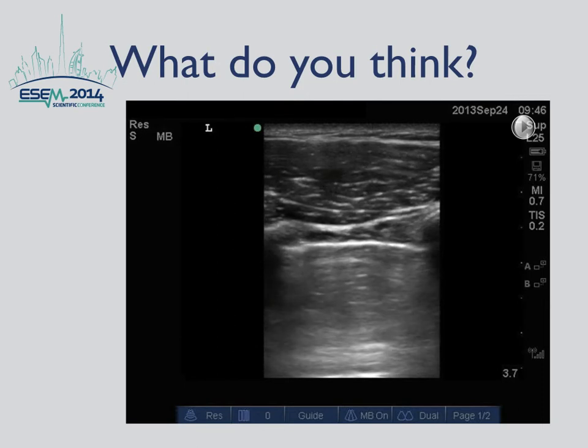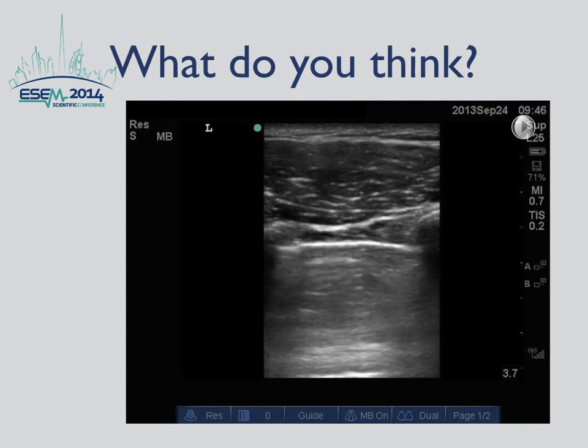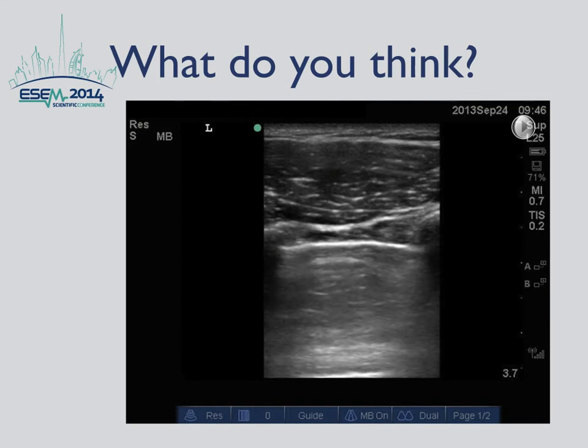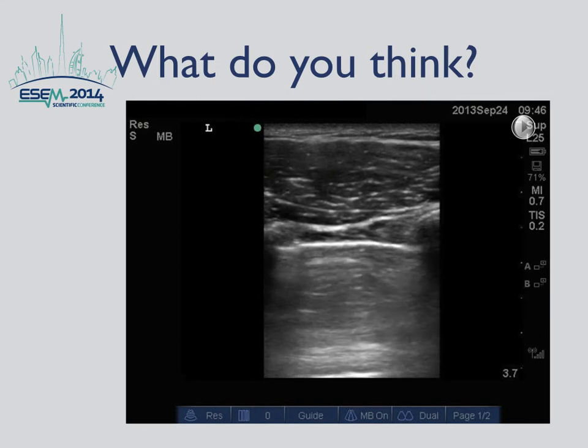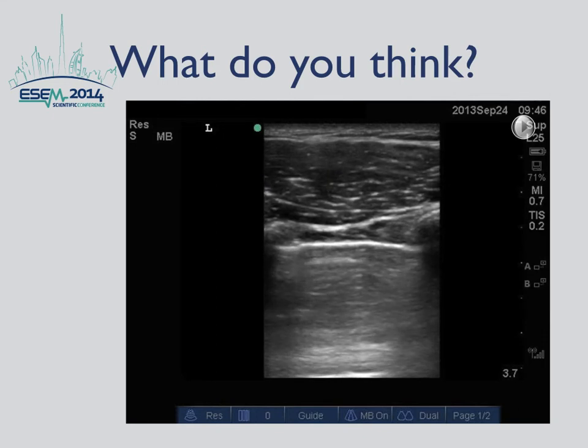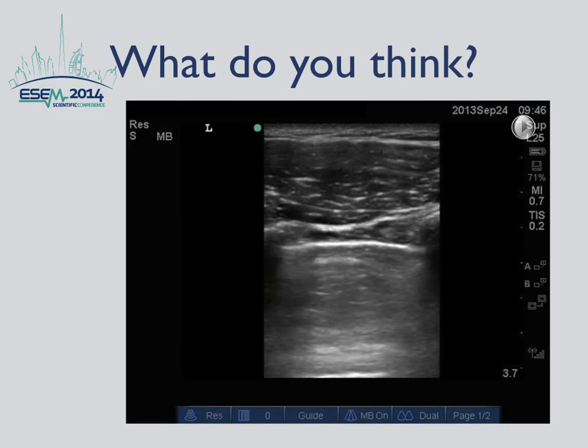in a poorly aerated lung. Cardiac activity is essentially detected at the pleural line where there is absent lung sliding. In normal, well-aerated lung, the lung pulse is not present, as the lung sliding becomes dominant and resistant to cardiac vibration.